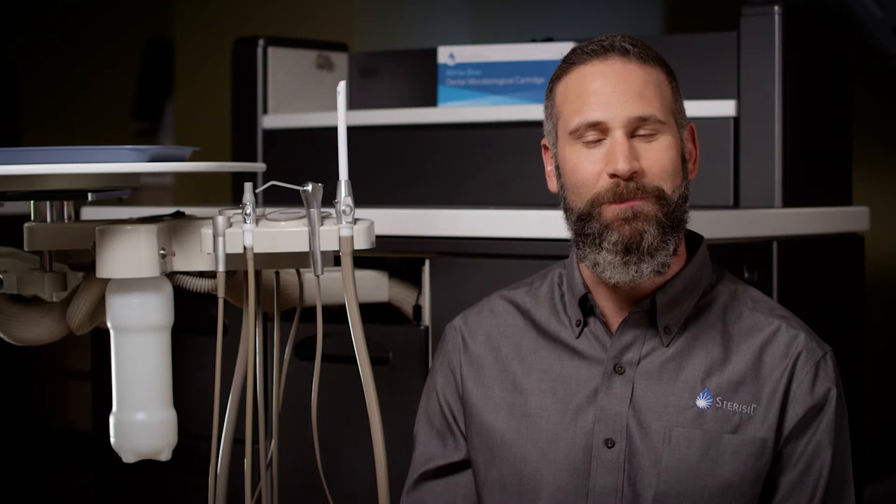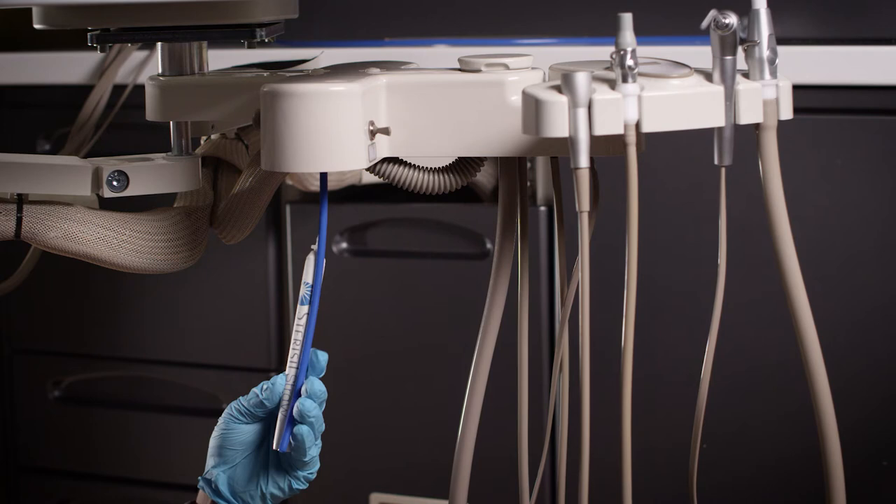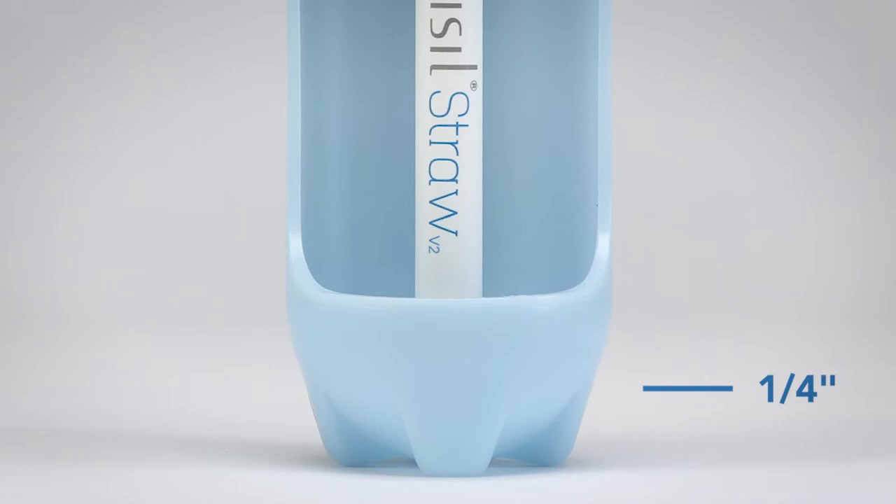Okay, let's go ahead and get this thing installed. Don't worry, it's totally simple. Begin by removing the bottle, exposing the existing pickup tube from the operatory chair. The appropriate length of the pickup tube is achieved when the straw cartridge is attached to the pickup tube and extends to within one quarter inch from the bottom of the bottle.